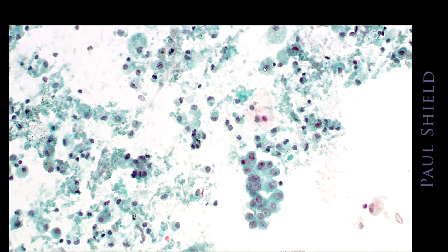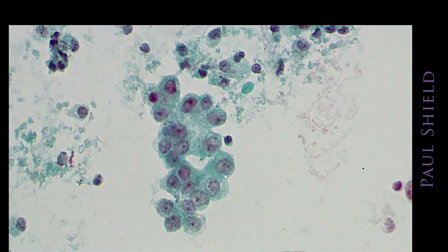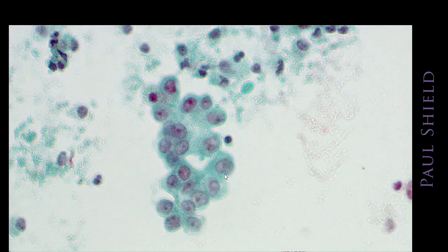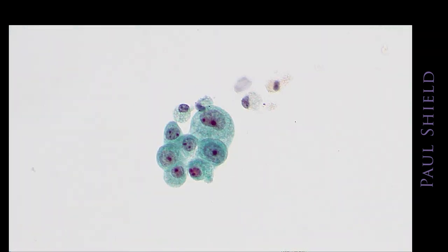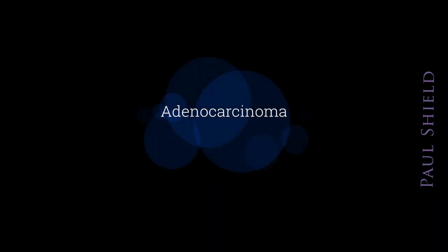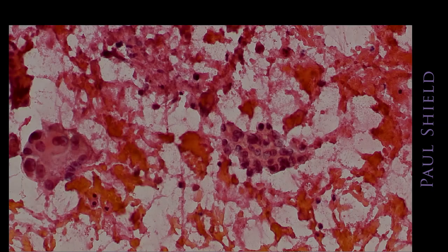This is just another group. You can see there's mainly debris and macrophages here, and then a few groups that are looking different, like this one here. It seems to be more cohesive, nuclei definitely larger, and those same features again, so prominent nucleoli, eccentric nuclei. It's almost like an acinar arrangement, or a couple of them there around a sort of luminal area. Finally, another one, you can see the nuclei are really quite enlarged over the macrophages in the background, but very fine chromatin. In washings and brushings, it can be variable.